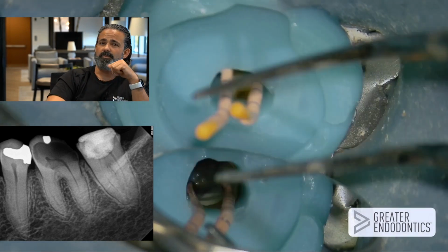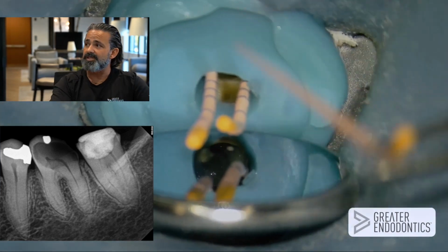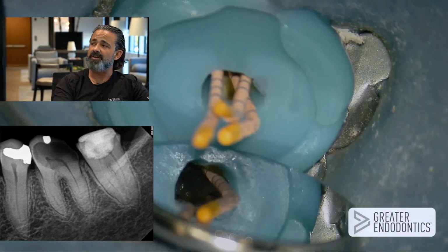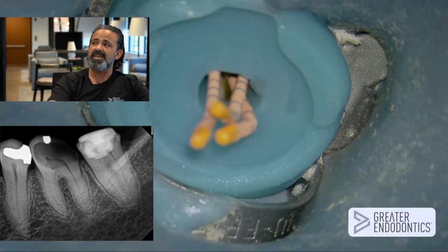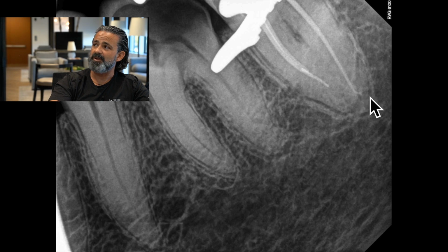All right, so finish the cycle. I'm putting some 2004 cones in there. Mind you, the last file I did before the GentleWave was a 2504. And I'm seeing that on those mesials, I'm right around 18. There's my short. And that makes sense. This is really where I like to see on normal GentleWave cases. I wanted to see it roughly about a millimeter or so, or to almost full tone of my apex locator.